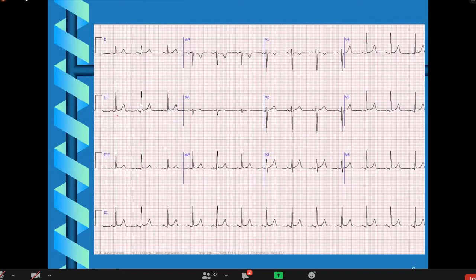It's very easy. After the intervals, you have to see the injury pattern. We see the injury pattern in the ST segment. This is the ST segment. It starts from the end of R and the beginning of T. If it goes below the baseline, we say ST depression. If it goes upward, we say ST elevation. There are different causes of ST elevation. But here there is no ST elevation, because for an elevation it should be more than 1 mm. This is less than 1 small square, so it's not significant from the baseline. If it ended at this place, then we could say ST elevation.